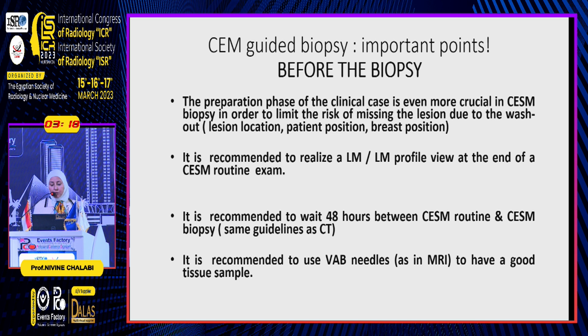Some important points to keep in mind before the biopsy, because the biopsy time is limited. This is a contrast study. The preparation phase of the clinical case is even more crucial in contrast than in stereotactic, so as to limit the risk of missing the lesion due to the washout. It is recommended to obtain a lateral view at the end of the contrast-enhanced mammography routine exam. It is recommended to wait 48 hours between the CESM routine and the CESM biopsy, and it is recommended to use preferably VAB needles, as in MRI, to have a good tissue sample.